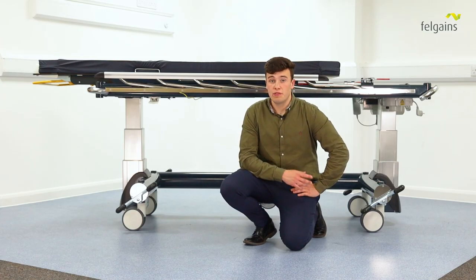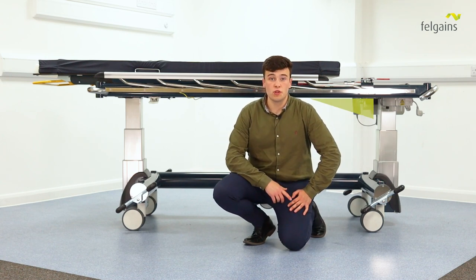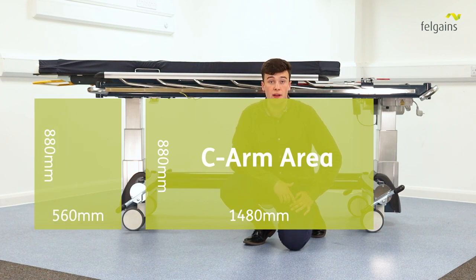So what is the benefit of this to you? Combined with the U-shaped base, this movement gives you a total available imaging area of 2,040 millimeters wide by 880 millimeters high. C-Arm imaging cameras can be large, cumbersome, expensive pieces of equipment.